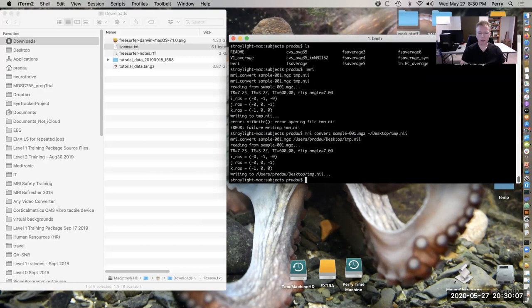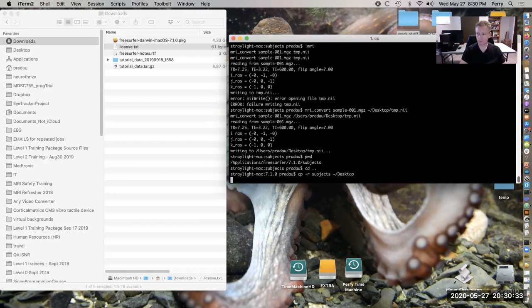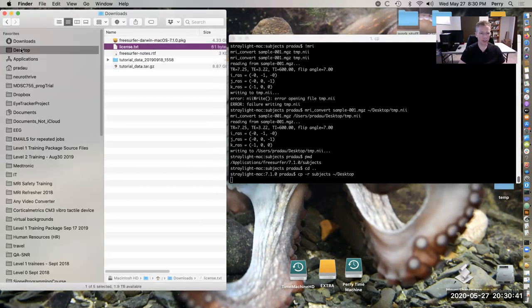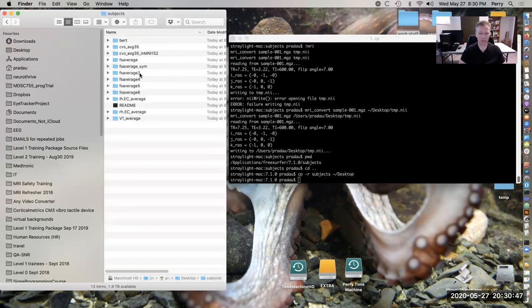And so you're good there. But because a lot of the tutorials are based on this subjects directory and you don't want to run into this issue again and again, I strongly suggest that you move the subjects directory out of applications and put it somewhere like desktop where you know that you have permission to read and write freely. So I'll do that. And of course, if we're going to make this change, then we have to change the corresponding variable. So here's the new subjects directory, which is just finishing copying.